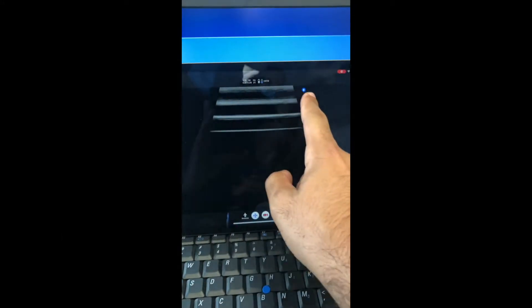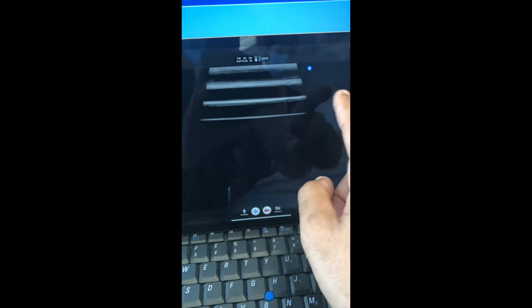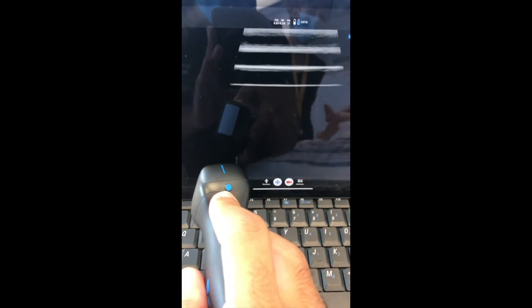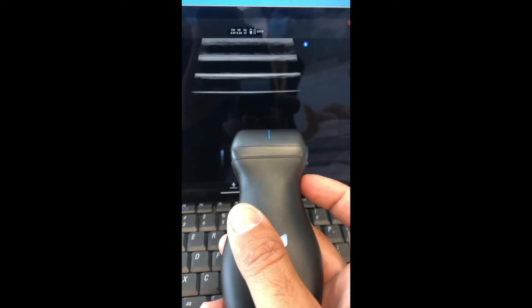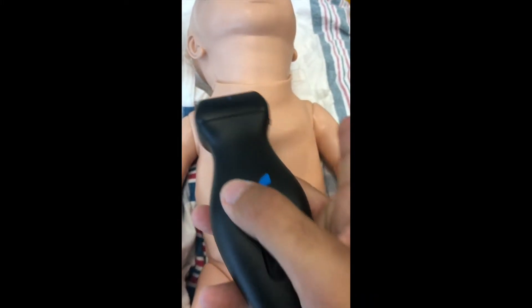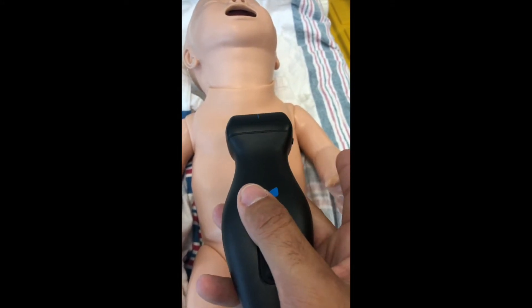By convention, you can choose where you're going to be putting the side of your probe. For typical cardiac ultrasound, usually your probe marker will be on the right side of the screen. This tells you that the pin here, which is the orientation of the probe, will be towards the left side of the patient. On the baby, this is the left arm of the patient and the pin of your probe will be towards this arm.